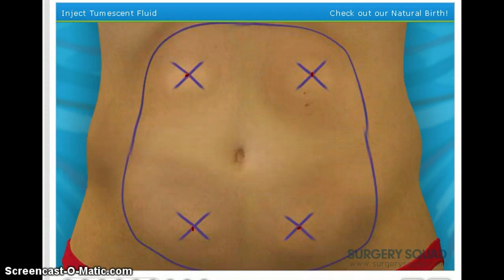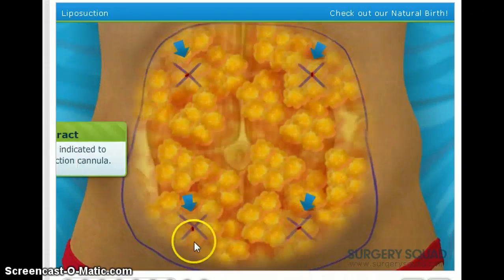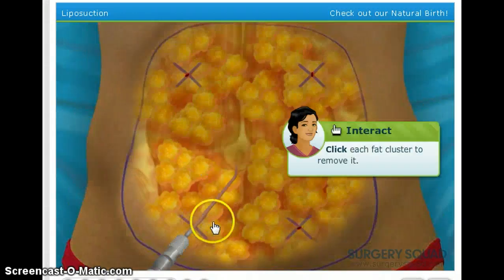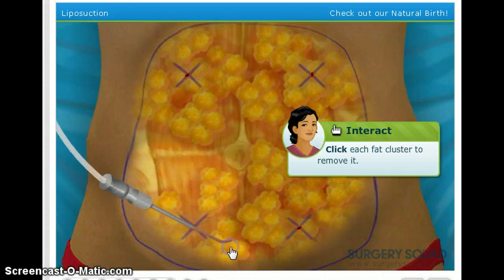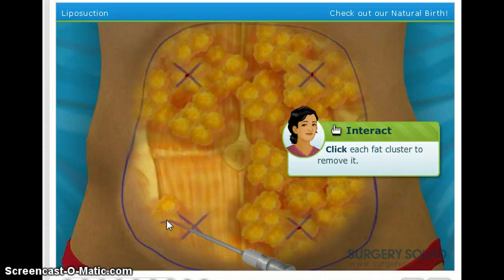Excellent job. Alrighty. Now that we've injected the tumescent fluid, let's begin the liposuction. Use the suction cannula to remove the fat deposits from the patient. This one, this one, this one.